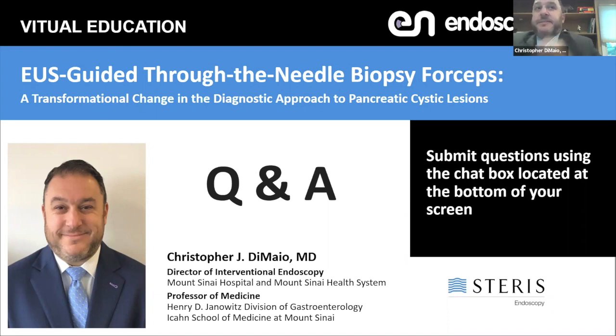So I'm not a pathologist, I'm not a cytologist, and I'm not going to pretend that I can speak at a high level to the processing techniques of both of those. But my approach when I use this tool is that I want to get a pathologic diagnosis. I would equate it like this. If you had a patient with an esophageal mass, you can brush it for cytology or you can biopsy it. My sense would be that a biopsy would give you much more information in terms of, is it well differentiated or poorly differentiated, as opposed to a cytology specimen. And also with a biopsy, you're just going to get a bigger piece of tissue, more tissue to work with, higher chance you're going to be able to do immunohistochemistry if need be. So it's the same concept with what to do with the MFB specimen, cytology or pathology.